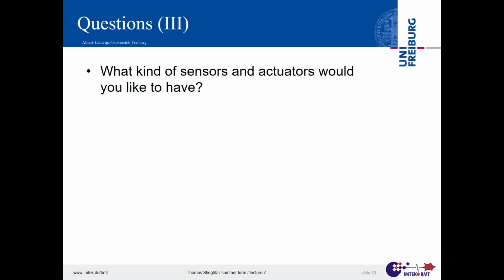Yeah, and then the question of sensors and actuators, that's manifold. I mean, we can all imagine all the metabolic monitoring that we would love to have. Is there glucose? What about the pH? What about whatever inflammation markers that we could see? Can't we do that optically? Then it could work if we come in with a kind of spectroscopy. Electrical parameters are probably difficult. It's all wettish, so it could be a bit of the impedance, but is that enough? That's difficult, especially if you don't know where you are and how close you are. Then it's more the volume conductivity of the intestine that you measure. So really difficult.